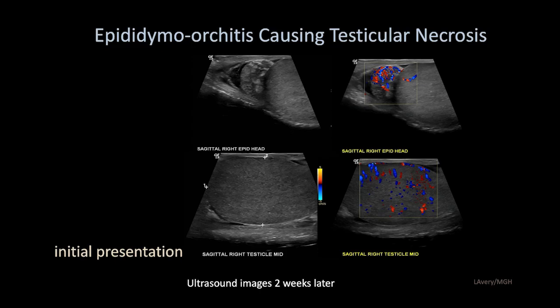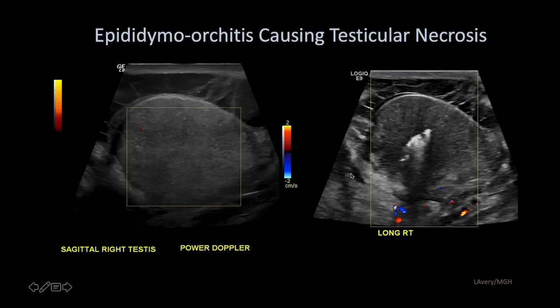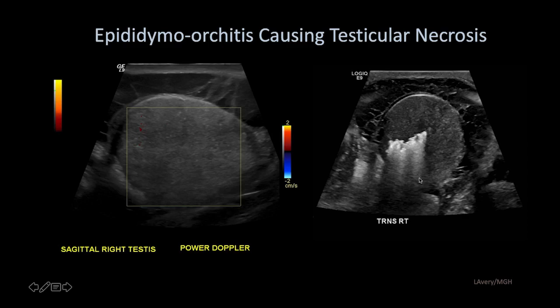Here's a case of very dramatic epididymal orchitis causing testicular necrosis. We see a classic appearance of a very enlarged, heterogeneous epididymis with increased vascular flow. The patient was treated but returned two weeks later with a large heterogeneous pyocele and hydrocele with a net-like appearance, enlargement, and very heterogeneous echo texture of the testicle. On Doppler flow, there was no flow even on power Doppler. Echogenic material with dirty shadowing consistent with air within the necrosed testicle was seen. Testicular necrosis can occur from severe epididymal orchitis.